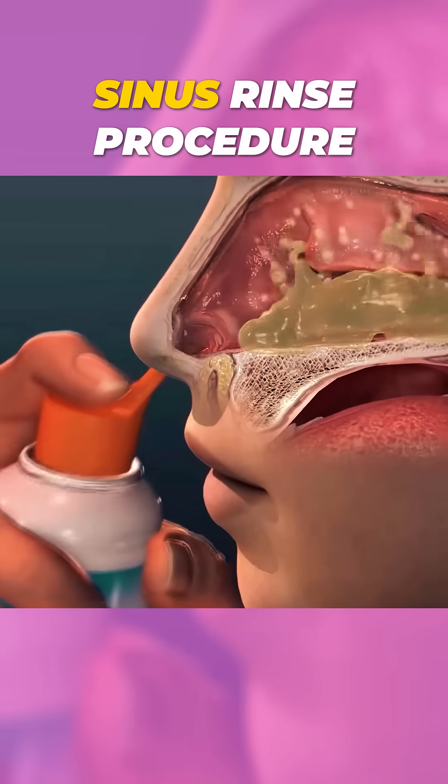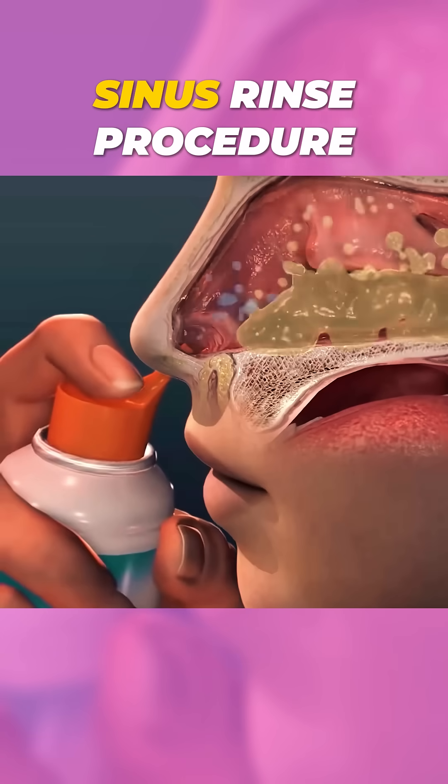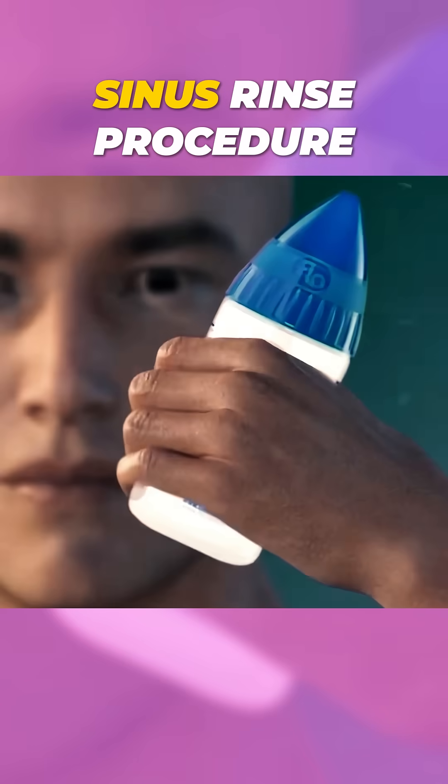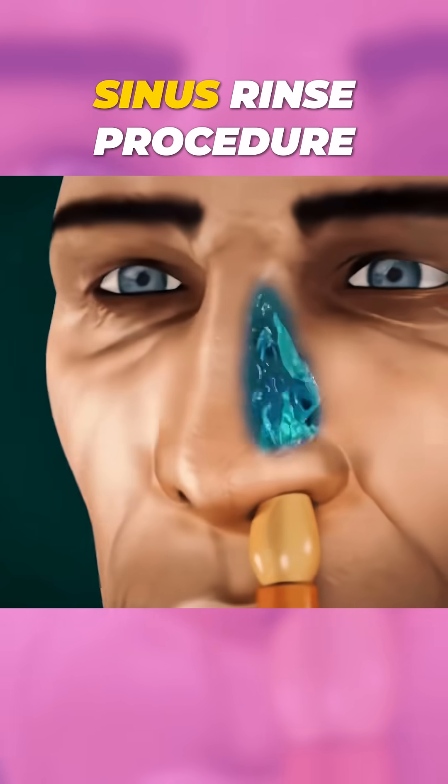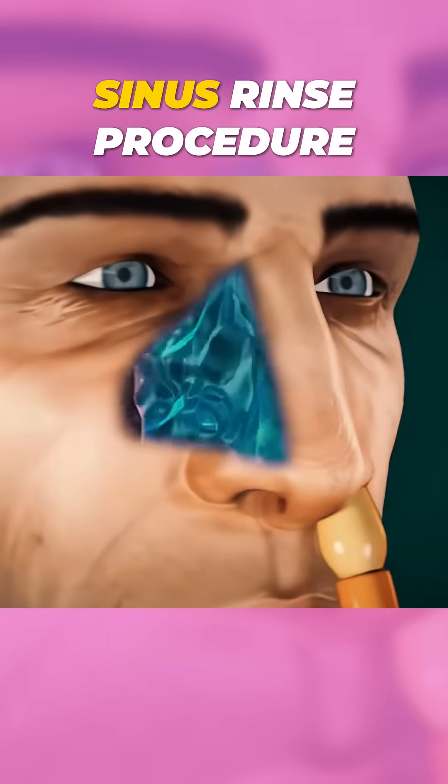Next, tilt your head over the sink and gently insert the nozzle into one nostril. Squeeze the bottle or pot slowly, allowing the saline to flow through your nasal passages and out the other nostril.